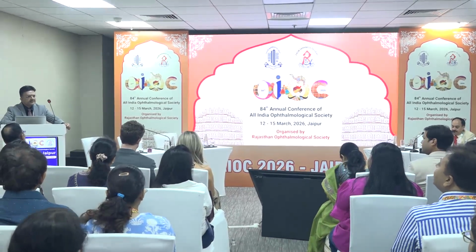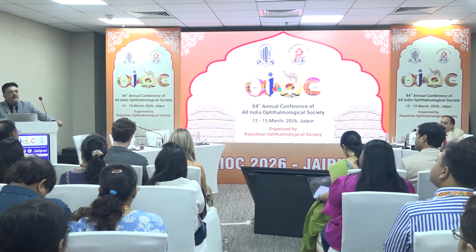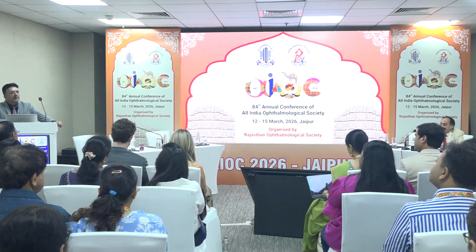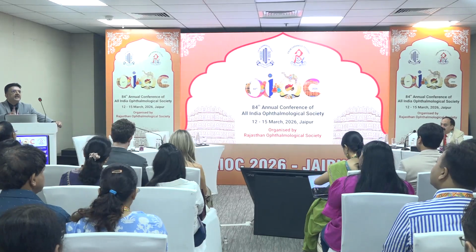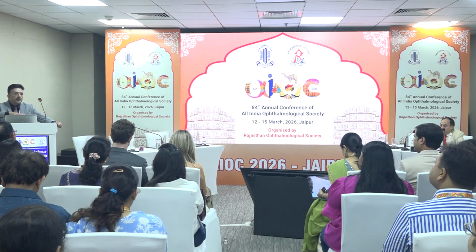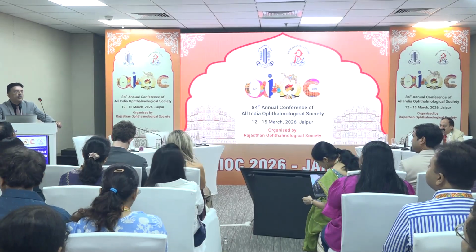Become unstable. That is the reason why we don't have single piece lenses for these high numbers. But yes, if you feel that there is a zonular laxity, if you feel that the bag is a little more floppy, then I think a CTR would be a very good option to support your IOL, as well as, I don't know of the PCO rate incidence, how does it go down or not, but yes, it's definitely a beautiful option.